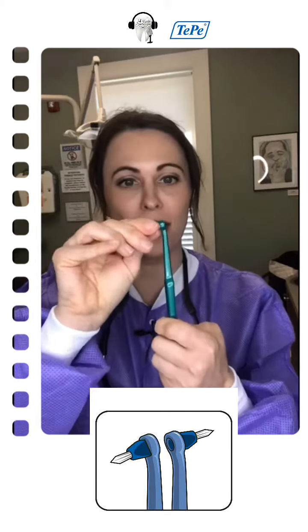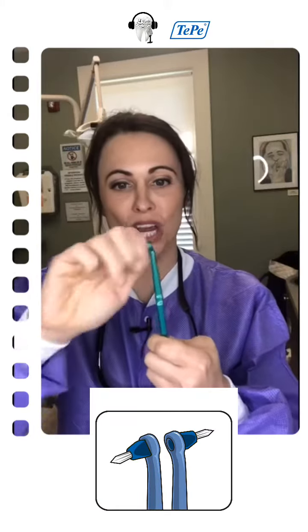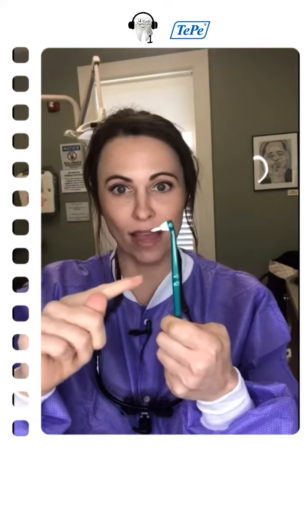What's great about the Interspace Brush is that it flips. This end is going to go away from the handle, so it's going to work for the facial aspects. Then I screw it off, flip it, and screw it back on, and it changes how it comes down at the handle.